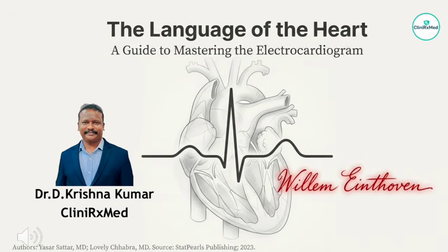Welcome to this presentation on the language of the heart, a comprehensive guide designed to help healthcare professionals master the interpretation of the electrocardiogram, ECG. Based on current 2023 clinical standards from StatPearls, we will explore how to translate electrical signals into meaningful clinical diagnoses.